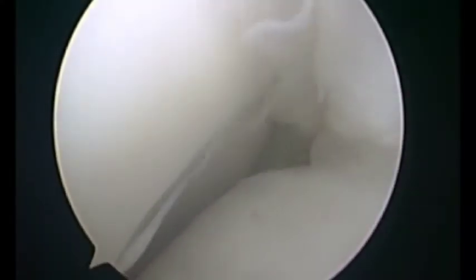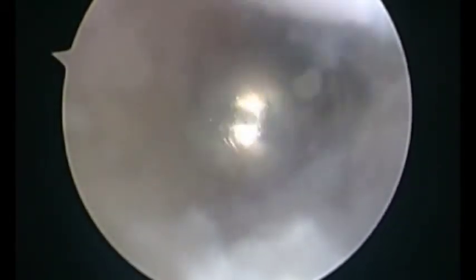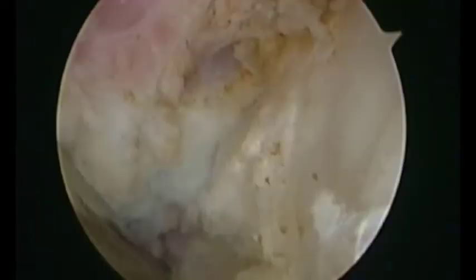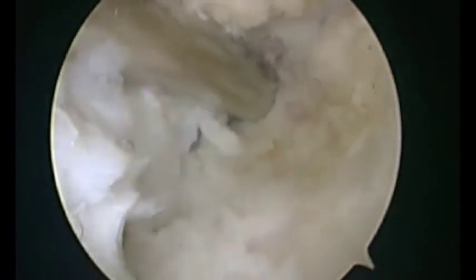Here we demonstrate that when the elbow is flexed to approximately 115 degrees, the radial head is no longer articulating with the capitellum. An osteotomy would correct this malalignment. Next, a 3.5 shaver is utilized to perform the initial debridement, taking care to direct the instrument away from the capsule and radial nerve. The shaver is then used to clear the anterior humerus of scar tissue and adherent capsule. We then make a proximal anterolateral portal to facilitate the osteotomy. The anterior apex of the deformity is visualized through the arthroscope and marked.